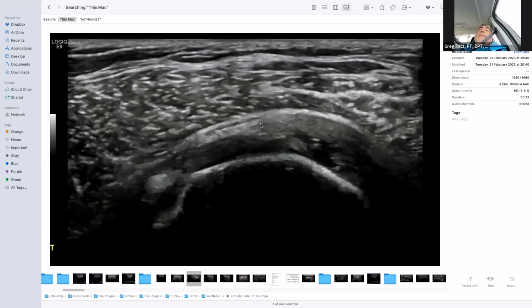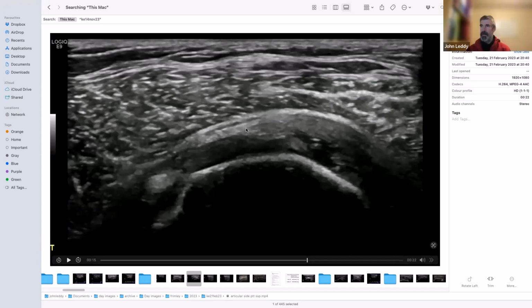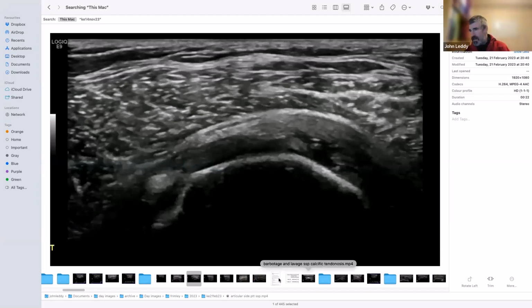We see deltoid at the top. We then see the thickened, or at least what looks like the bursa, and the tissue between. Are you too medial for the rotator cuff cable? No, the rotator cuff cable will be, you can't see it on this one, but it will be in a line down here, just overlying the cartilage, going right across, and then sliding up here. It'll be 90 degrees to the fibers of the short axis supraspinatus.